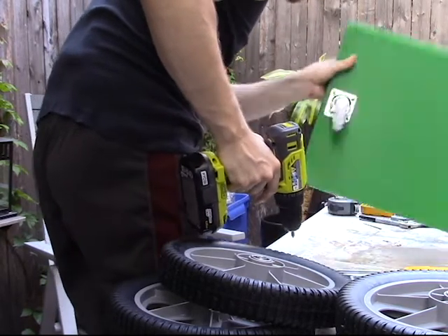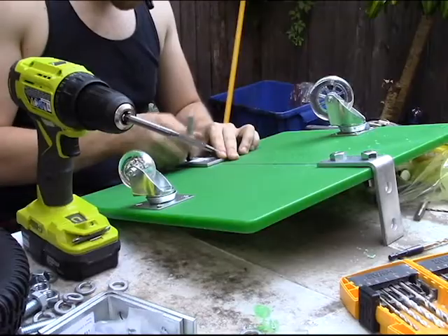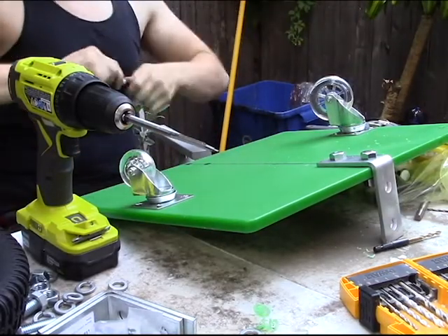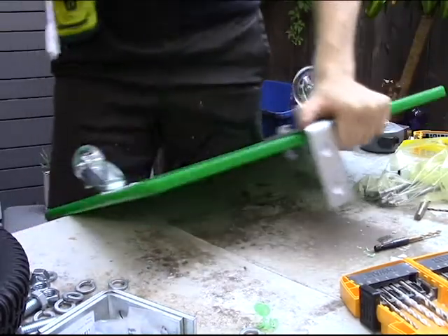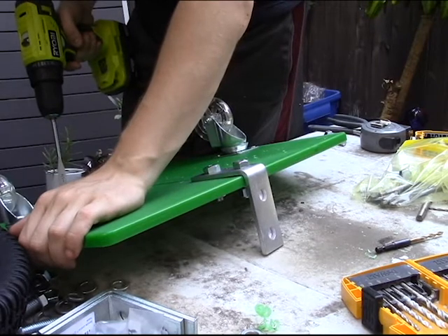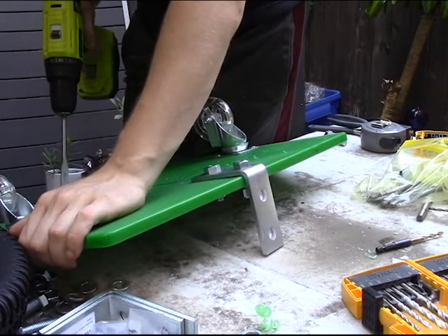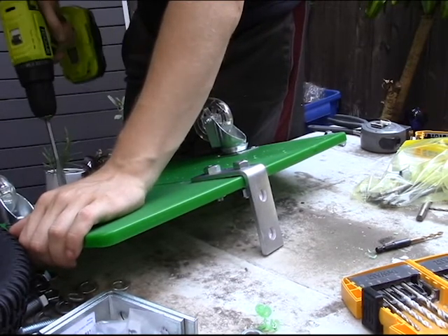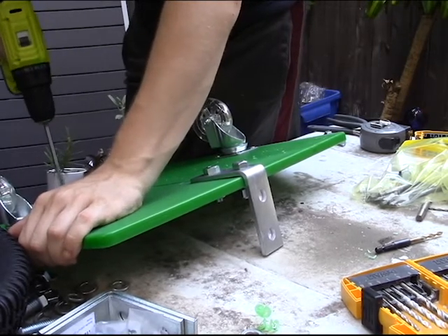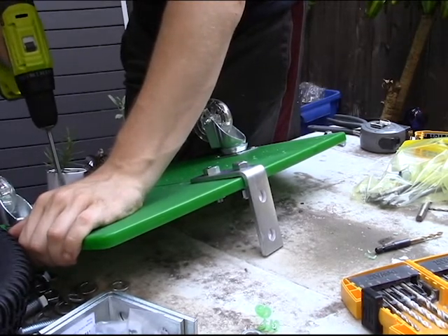Once the casters are attached to the base, we can attach the L brackets, which will hold the large tires. You will place the center of the L bracket nine and a half inches from the smaller caster wheel side. Once the line is measured, you can place the L bracket in place, outline the hole, and drill. You can connect the L bracket to the cutting board with the large nuts and bolts. Be sure to tighten them firmly.